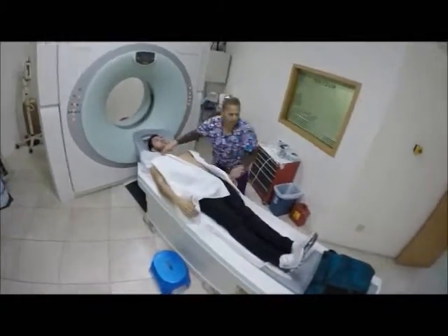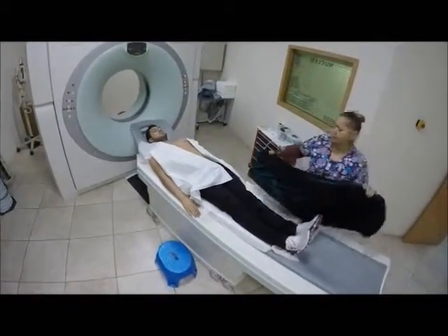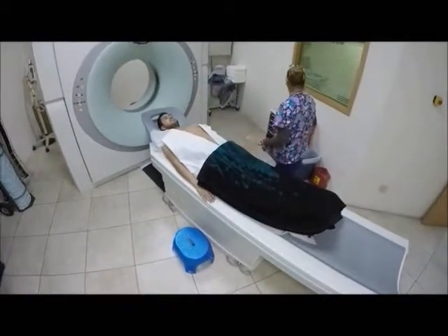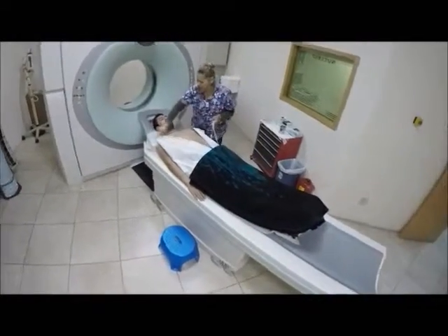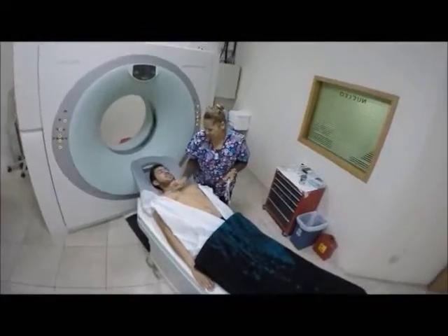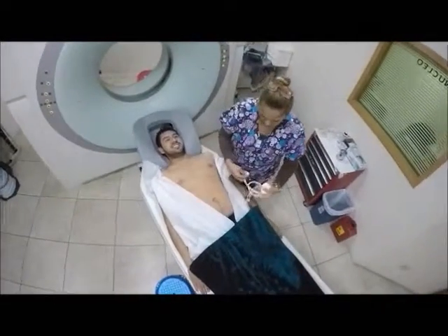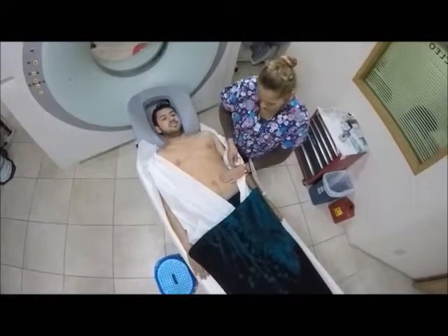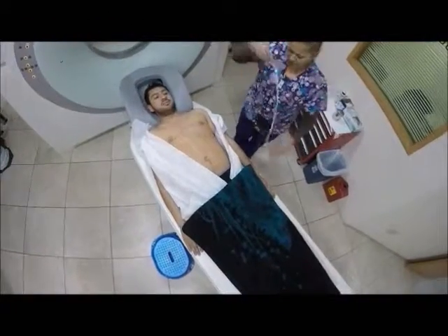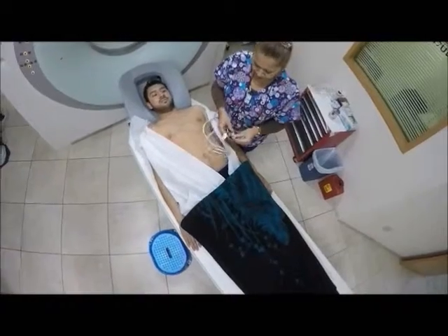You will be asked to lay on a narrow examination table that slides into and out of the scanner. The technologist will clean three small areas of your chest and place electrodes on these areas. Men may require a small area of hair to be shaved on their chest to help the electrodes stick.